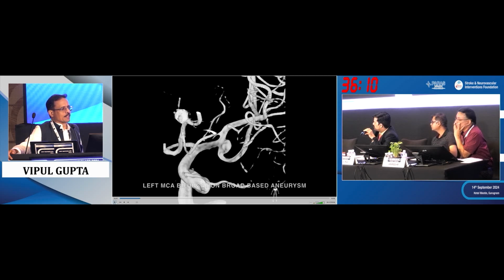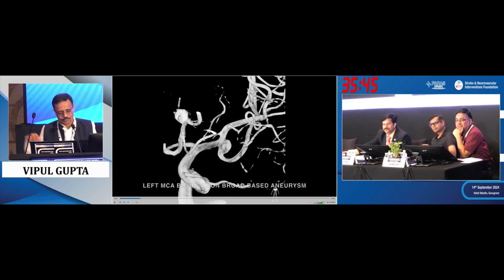Dr. Rahul is there. He's a keen neurosurgeon. Or nowadays you can have Contour plus stent. Definitely, as everybody said, and as Vipul also said, clipping has to be compared with the coiling method. Definitely, clipping is very straightforward in this case.